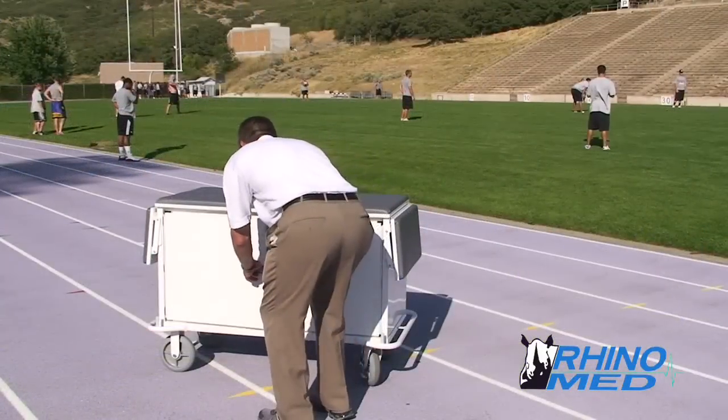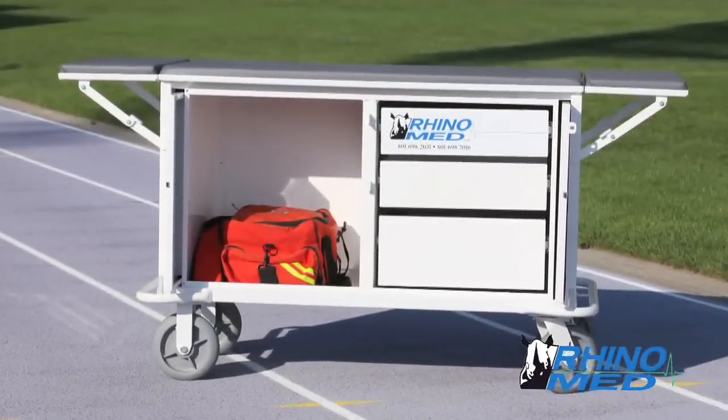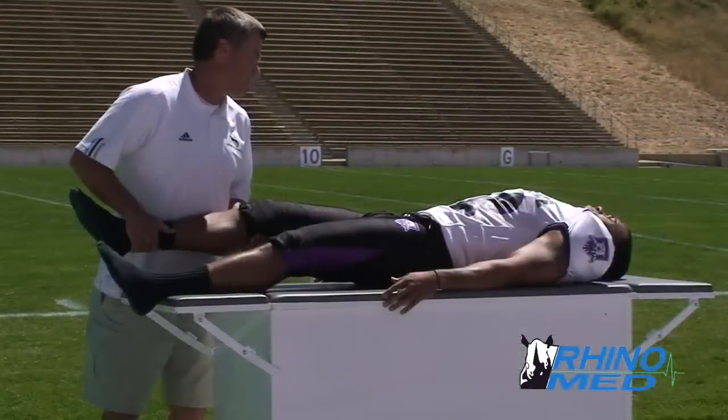The RhinoMed cart is built to exacting standards in the United States by the leading metal equipment fabricator, Dutro Company, from the highest quality materials for a lifetime of use.